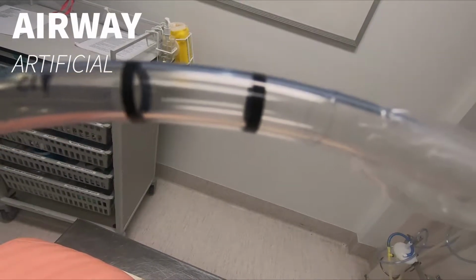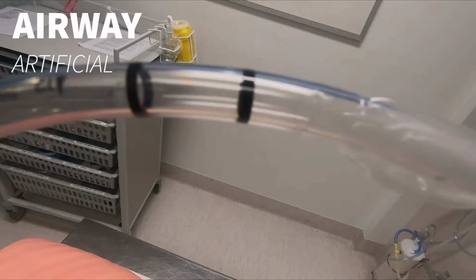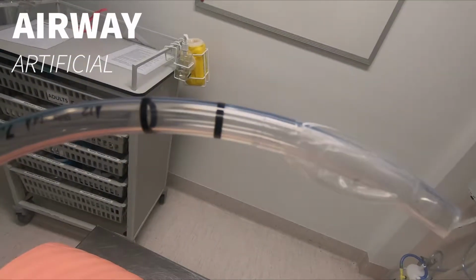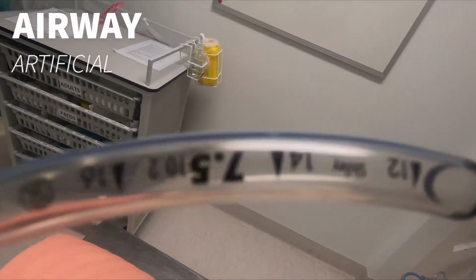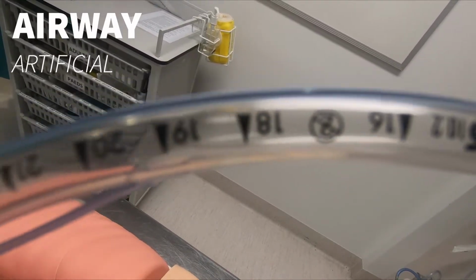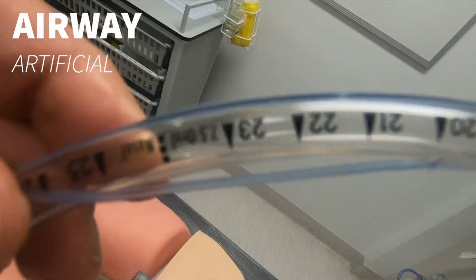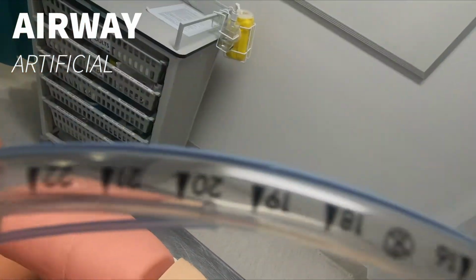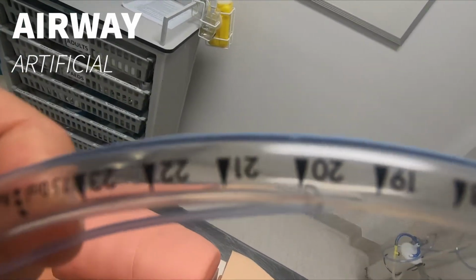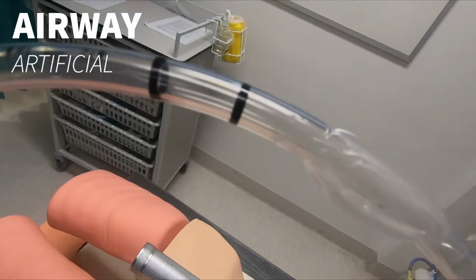These two black lines are markers, so the vocal cords need to be in between these two black lines, indicating that the endotracheal tube is in the right position. And then here on the tube itself, there's the size, so it's a 7.5. And you see markings here, so you can see these markings at the lips and decide that it is, for example, 22 on the lips or 21 on the lips. You know the depth.